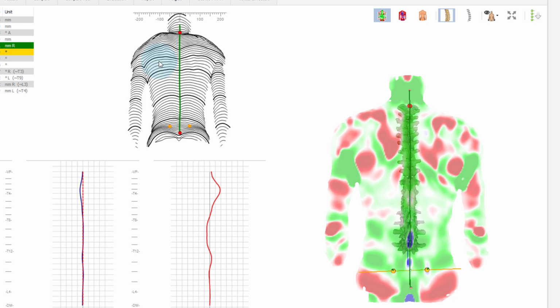A fingertip guided from one axillary point to the other moves into a local depression at the level of the spinous processes. This results in a blue coloration in the mean curvature. If the fingertip now descends from C7, it presumably meets the convex structure of the kyphosis. This results in a concavity in the horizontal and a convexity in the vertical at the same point. This leads to the green coloring in the Gaussian curvature.